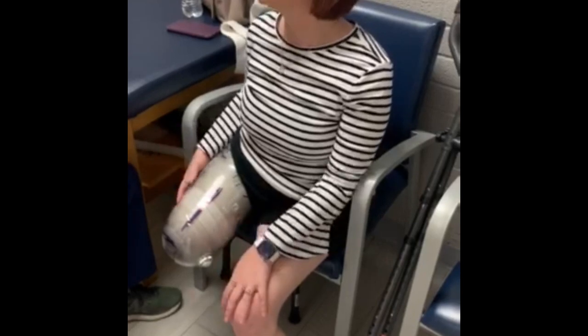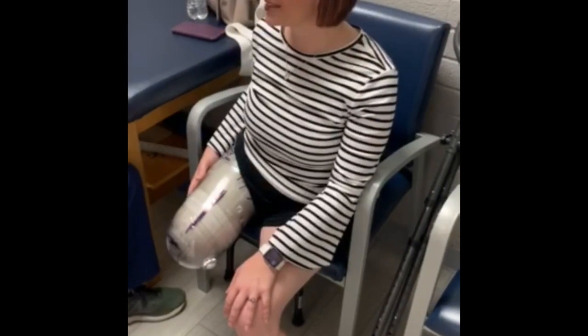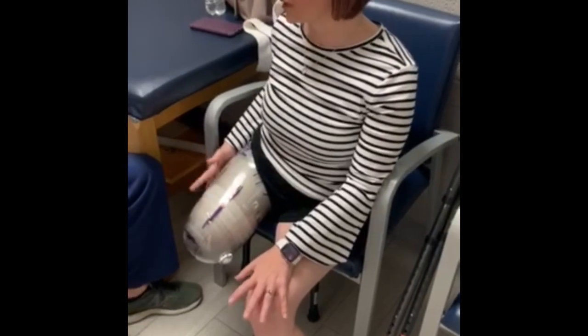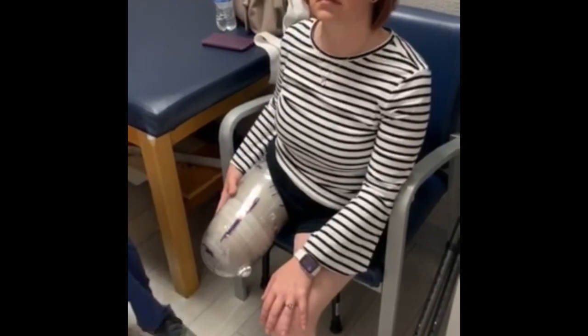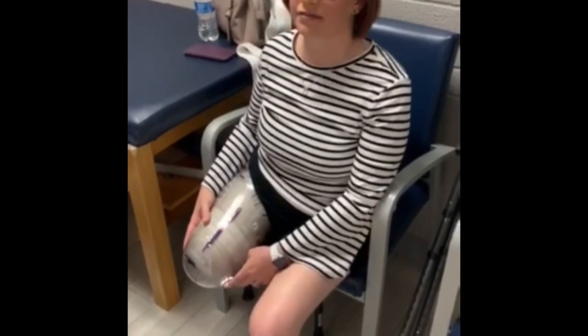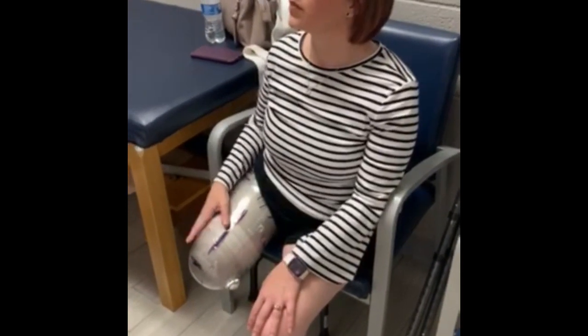But it's not fully on now. So you'd have to remember when you go to stand up. I call it your putting on dance. Now you could probably just get it in a few steps if it was flat and level and you're not in a crowd of people. In doing that, when she returned to standing, she would need to hit that release and fit it. You don't necessarily have to hit the release, depending on how far you took it off.